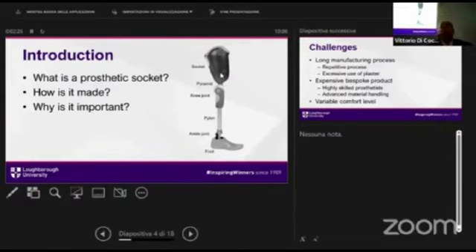It's a very long artisan procedure where each limb is measured several times, and then the socket is manually adjusted, not that differently from how sculptures are made, but the sculpture is an internal one, clearly, and then people are using it.